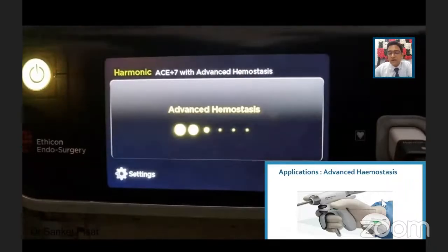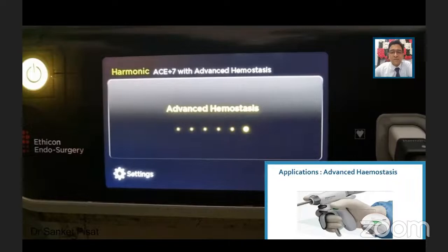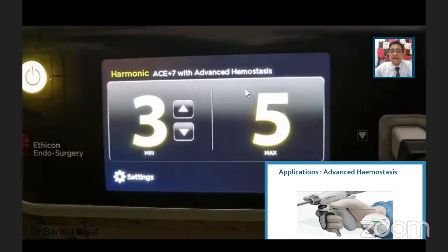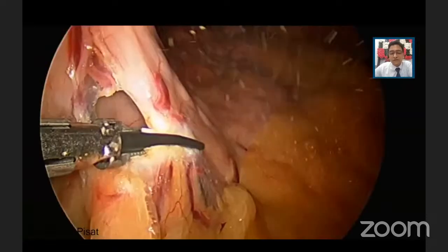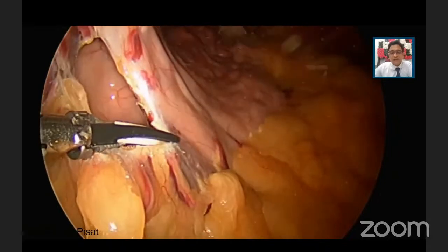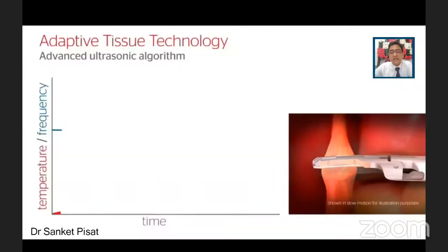There is a small green button available on the side of the handpiece, and when you press advanced hemostasis, it causes more coagulation of the tissues, and thereby gives you better hemostasis. Now, one important thing to understand is, though we are using advanced hemostasis, there is still no current flowing through the patient. So how does this advanced hemostasis really work if there is no current flowing through the patient for the purpose of causing coagulation?